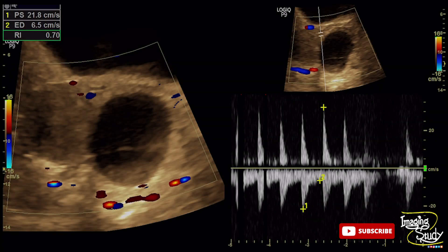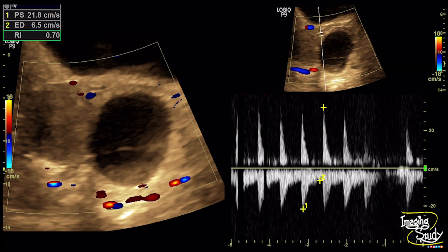Color Doppler shows no vascularity within the lesion and the most adjacent blood vessel shows a high-resistant flow pattern. The resistive index was 0.7 and the wave pattern shows the feature of uterine arterial origin because there is an early diastolic notch present within the wave. This virtually excludes the chance of differential diagnosis, that is ectopic pregnancy.